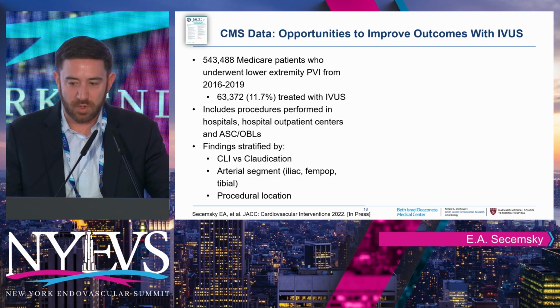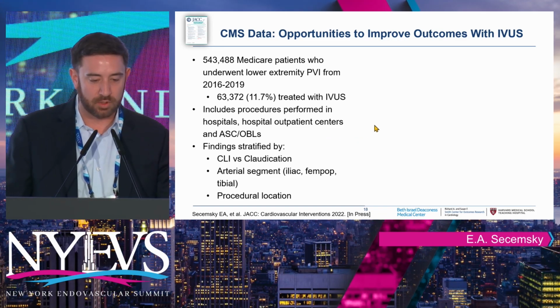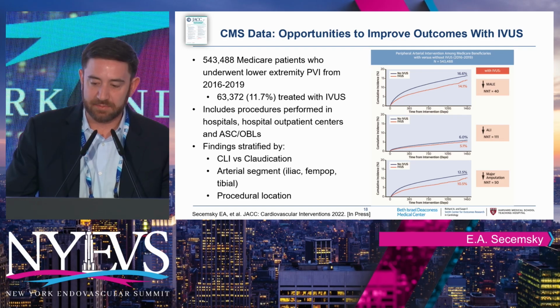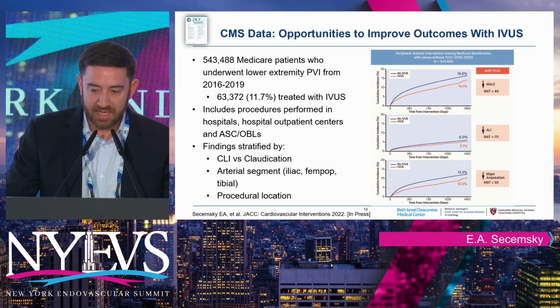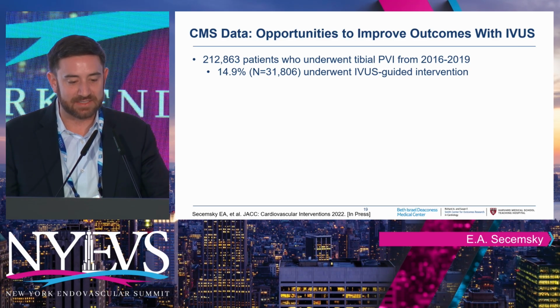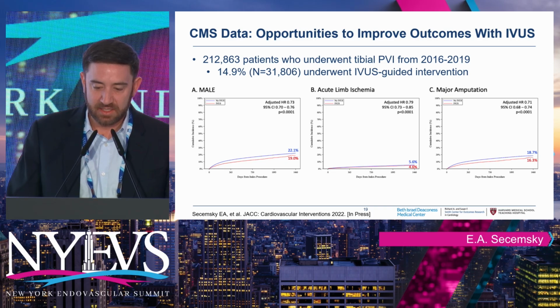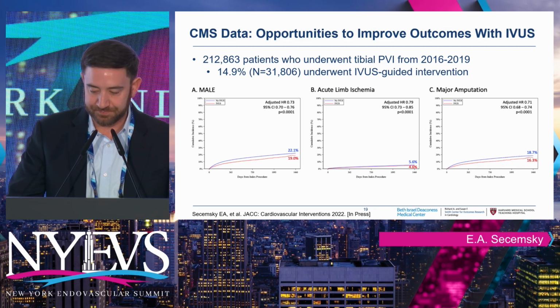When we extend the trial data with patency and restenosis endpoints out to clinical outcomes, we go back to our real-world evidence. This is a large study we did several years ago, 500,000 patients, and we looked at IVUS in red versus no IVUS, demonstrating improvements in major adverse limb events, acute limb ischemia, and major amputation. And when you only look at the infrapopliteal segment, again, that's where a majority of our IVUS guidance was. A lot of operators in the US are using IVUS for infrapopliteal in particular. Again, you see a highlight in improvement in major adverse limb events, some small reductions in acute limb ischemia, and even some signals of improvement in major amputation.